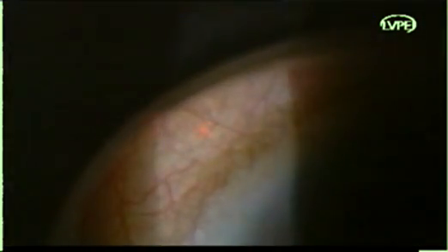The iridotomy should be placed in the periphery of the iris to reduce the likelihood of lens injury and subsequent sealing of the iridotomy by posterior synechia to the lens. A site between 11 o'clock and 1 o'clock is preferable, as it would help minimize glare and diplopia. In the presence of a dense arcus senilis, the iridotomy site must be central to it.